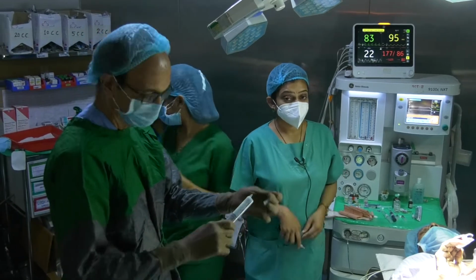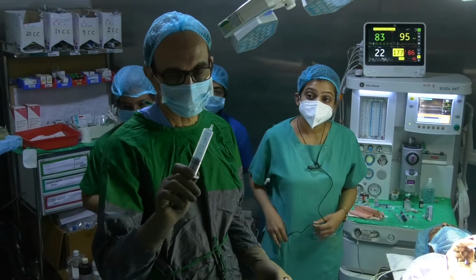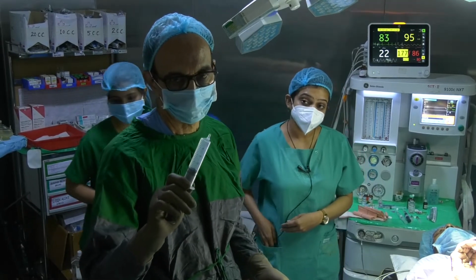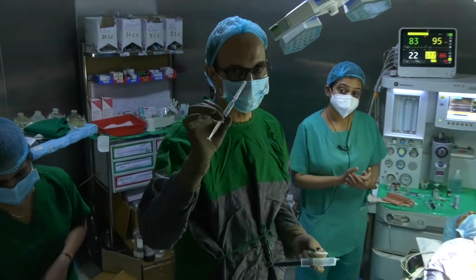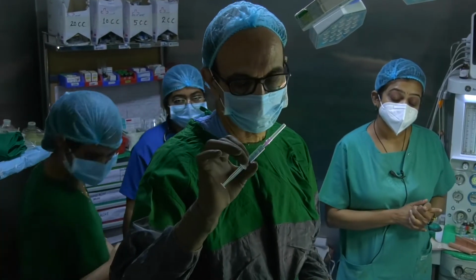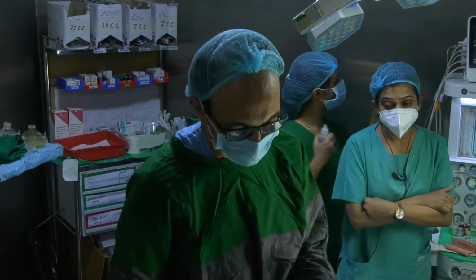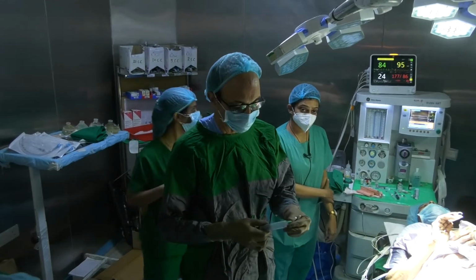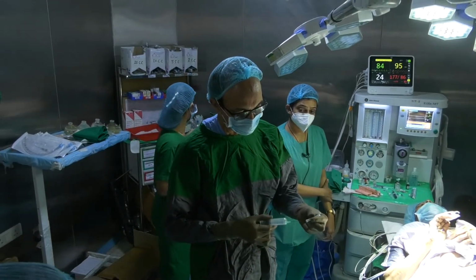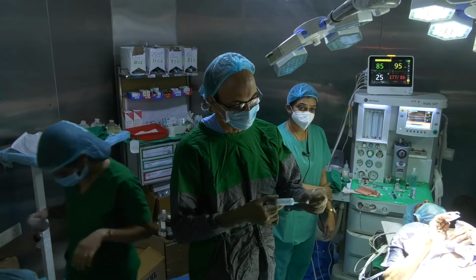This is 0.25% levobupivacaine. I have taken from the same vial, and this is 2 ml of isobaric levobupivacaine from the same vial. This is for the block, which I will be demonstrating now, and after that we will be giving continuous spinal with epidural catheter. This is how I will bend the tip of the needle.